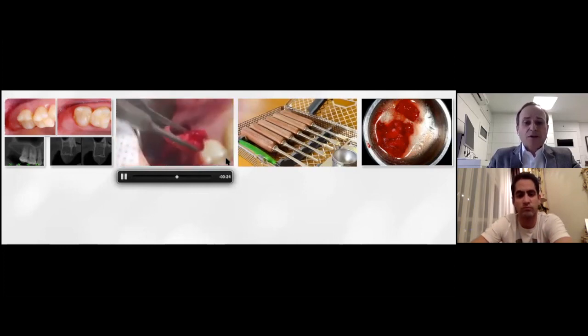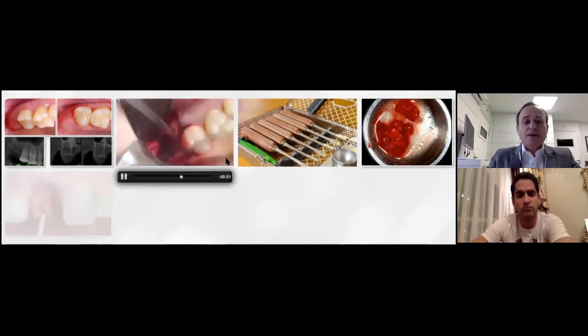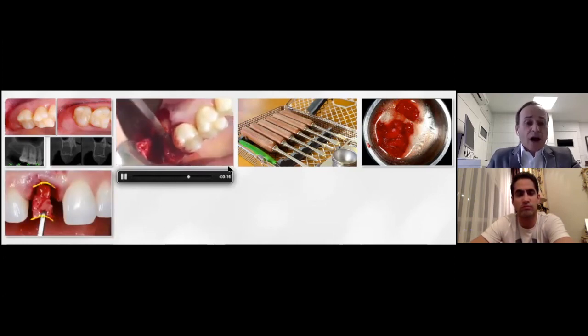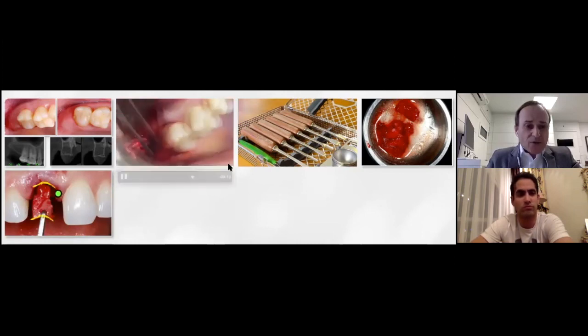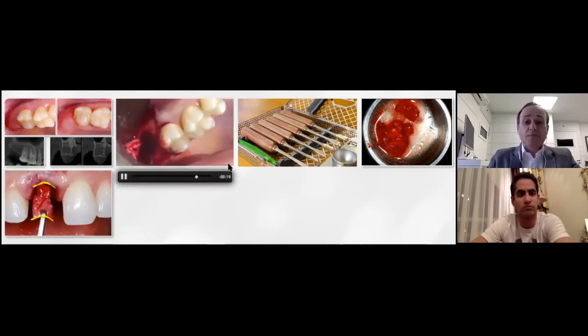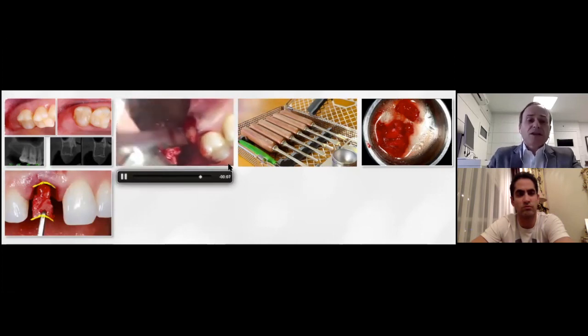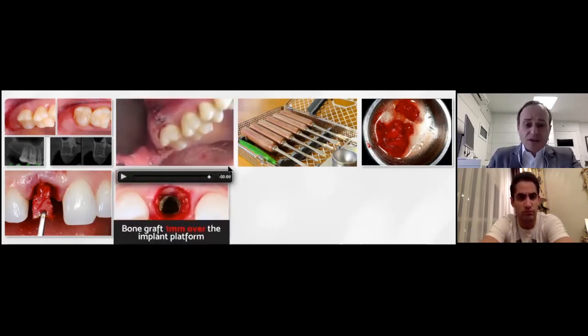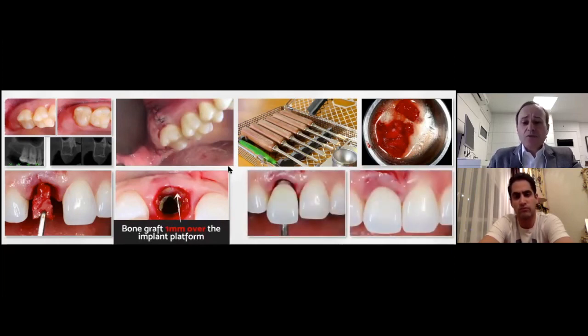As soon as we fracture the bone, as you can see here, we get the cortical cancellous graft that can be used to restore the buccal wall that the patient had lost. We also match the cervical portion of the graft with the outline of the gingival margin in order to restore the bone architecture. It's necessary to harvest more bone to be crushed and filled. After this particulate bone is completely packed, we leave the bone graft 1 millimeter over the implant platform. We installed the provisional restoration, of course out of occlusion; the occlusion was protected by the neighboring teeth.